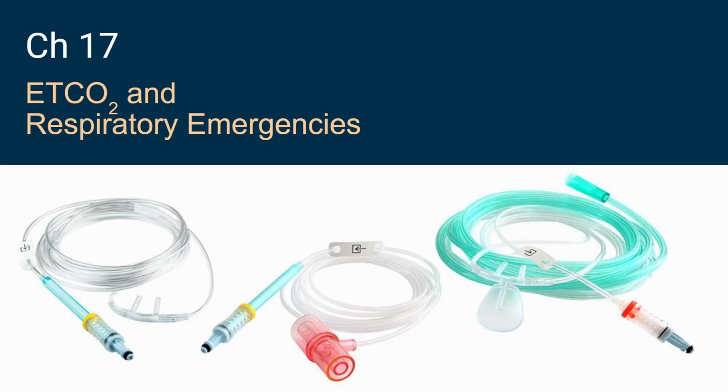End tidal is its own animal, and I think I can save you a lot of time going through it. Now, moving through the AEMT course, my expectations for scenarios and practicals in most cases are that you do all of your new toys each time, but not at the cost of patient care. Yes, I expect you to do an IV on every mannequin in every scenario. Not at the cost of patient care though. If my guy's hypoxic and you're so busy starting a line, that's not great, right? It would be better that you didn't get the 2 points that you would get on a practical for doing an IV that you're not going to do anything with than it would be delaying ventilation.